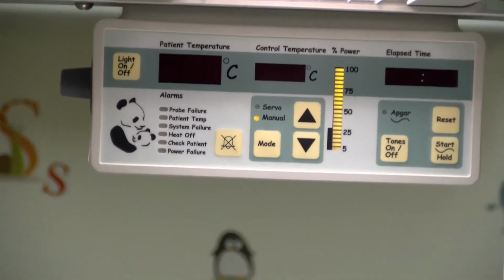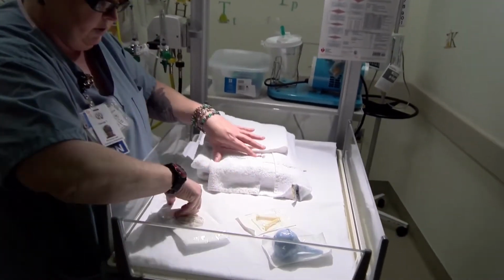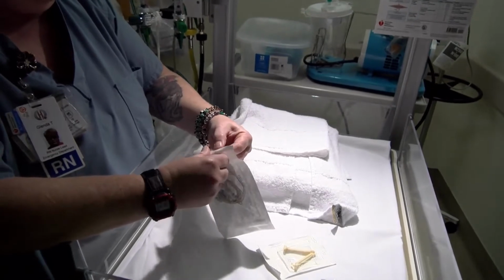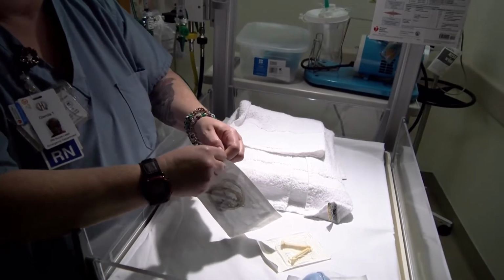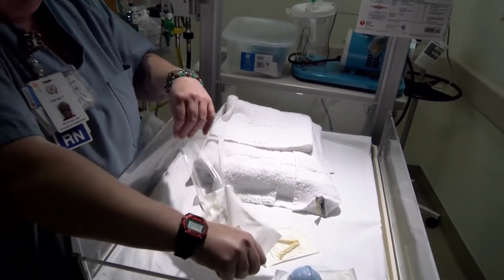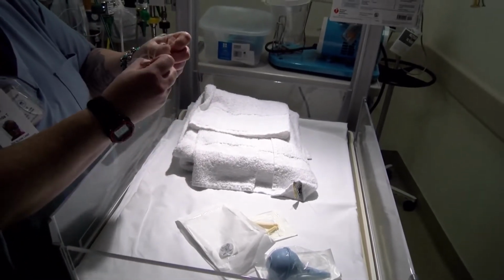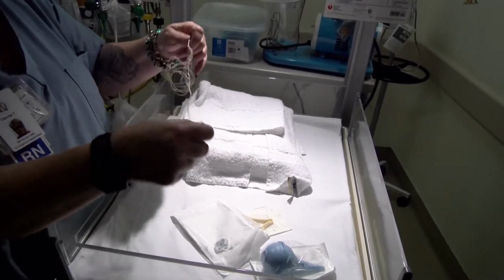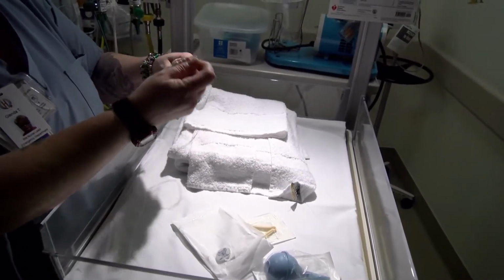Make sure you have towels out, a blue bulb syringe, a cord clamp, and your thermometer probe. You're going to open up your thermometer probe. So the probe is one-time use only. It is disposable, so we will not be cleaning this and reusing it. And as you can see, it is a spaghetti monster to untangle.